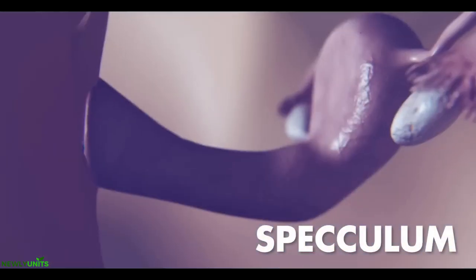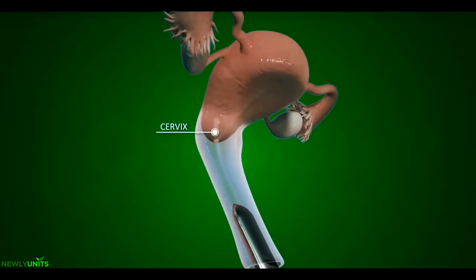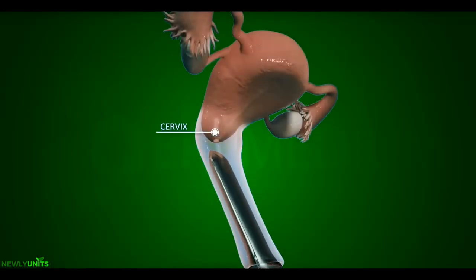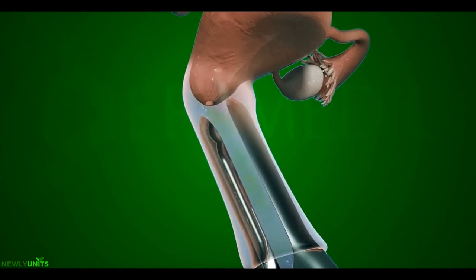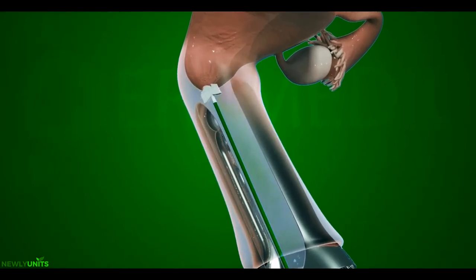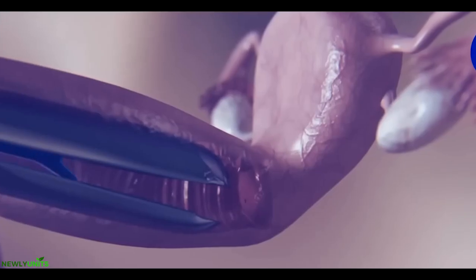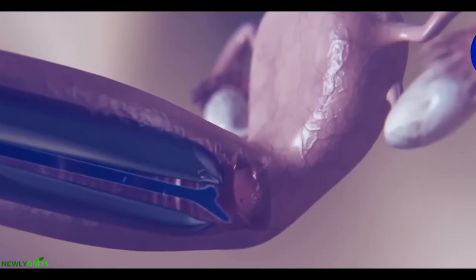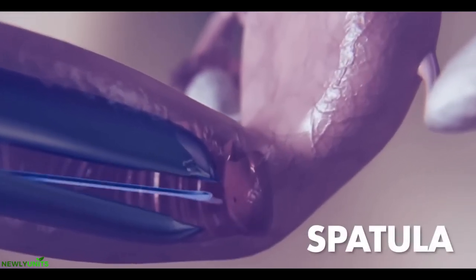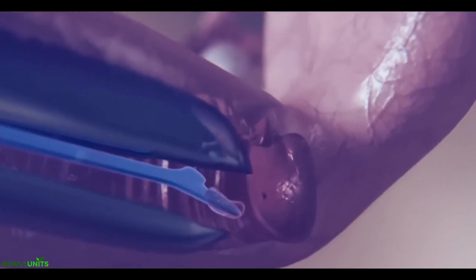Now we have to take a look at the speculum. If you take a look at the speculum, you can see the speculum. Then we have to take a look at the speculum, and you can review the reports.